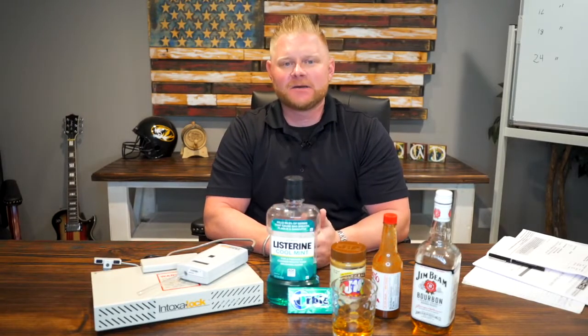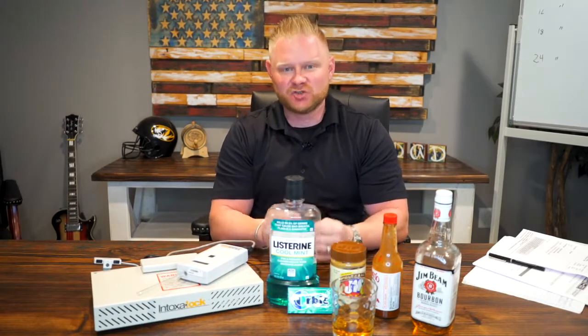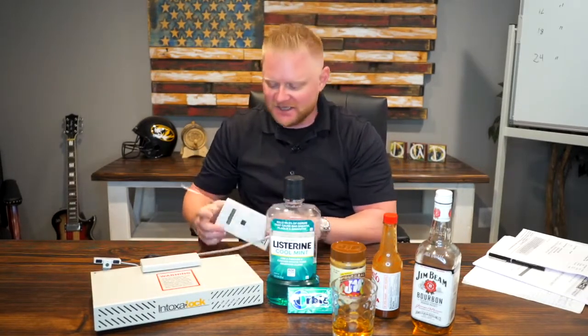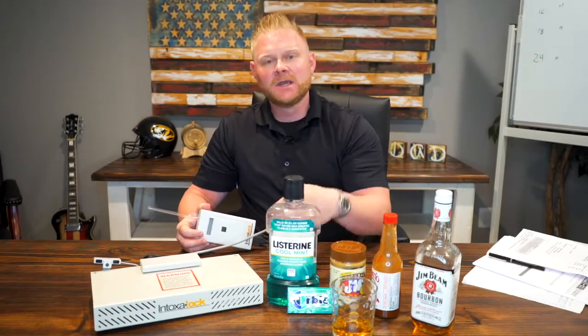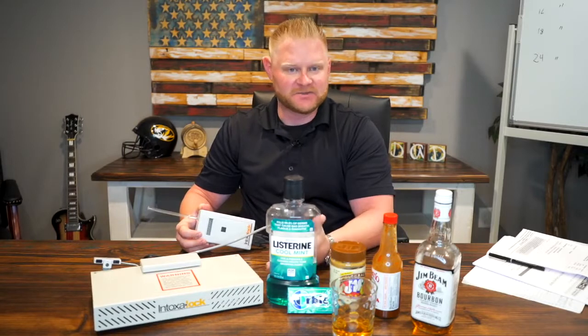Today I wanted to talk to you guys about some theories of how to be able to trip an ignition interlock device. As you're seeing here, this is a real sample of an ignition interlock device. Obviously this is not plugged in, but basically what this does is it measures your blood alcohol content, which people are required to put on their vehicles after a DUI or subsequent offense.